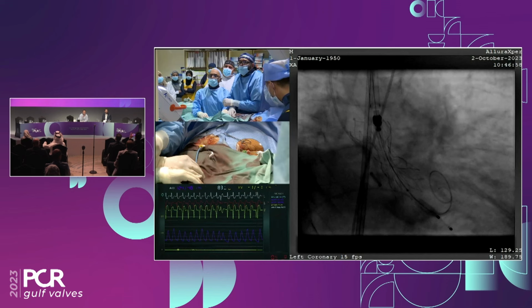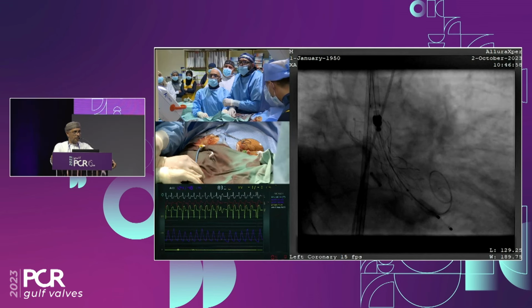If there is mild calcification in the CT, you don't need to pre-dilate with a Navitor. But if you have moderate or severe calcification, you need to. As you said, Ahmed, because it's large cells, there is less metal. It's a trade-off. More metal with other systems, you don't need to pre-dilate, but less metal, more cells. The price is you have to pre-dilate, but you don't have to pre-dilate aggressively.